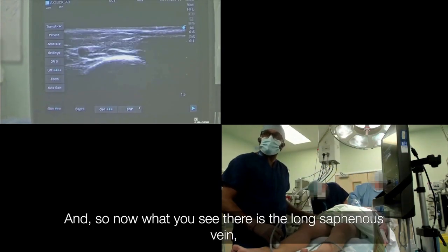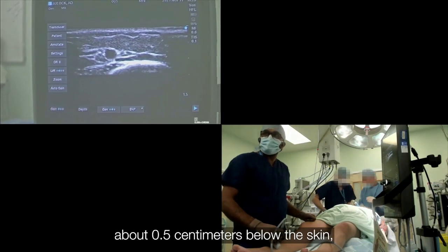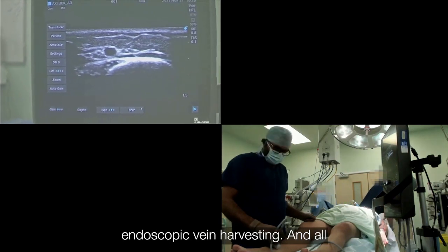What you see there is the long saphenous vein — the black dot in the middle. It is about 0.5 cm below the skin, which is a perfect depth for endoscopic vein harvesting.